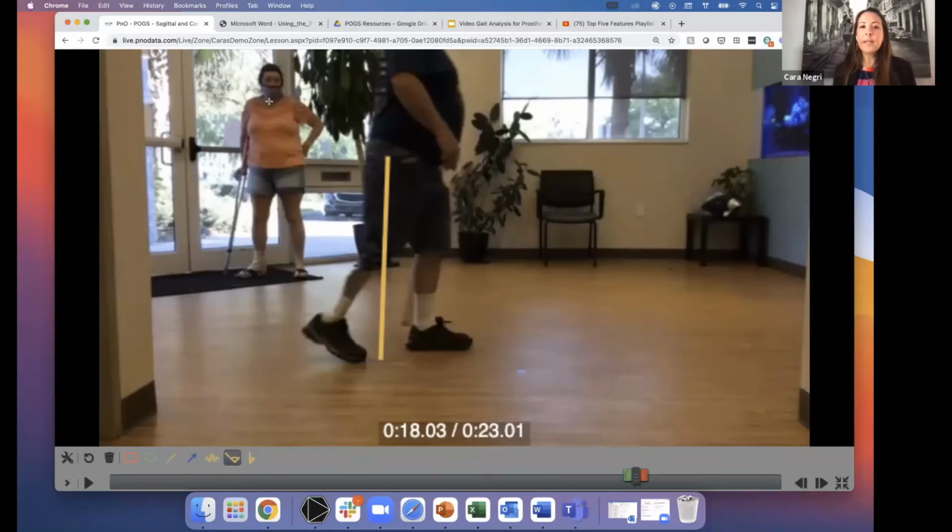If you have the ability, lighting is also a big deal, to Dr. Havorka's point, as far as measurement errors with these darker colors. If you have the ability to place a light, I probably could have put a small little LED light here that would really help me with this video. So that's another thing that you can do.